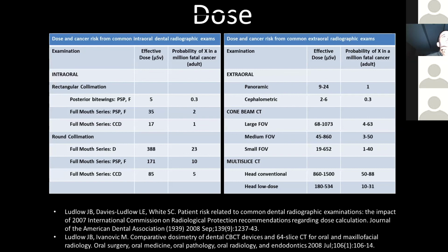Okay. Would it be possible to pull bite wings off a recreated panorex for a patient with strong gag reflex, where good quality bite wings have not been obtainable? Not from a cone beam CT. The resolution isn't there. But what might be acceptable would be extraoral bite wings, if you have a unit that manages or acquires those.